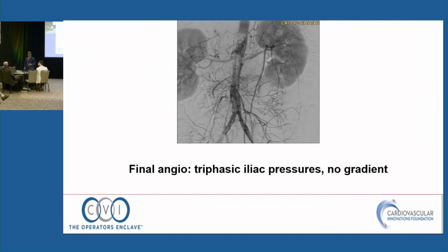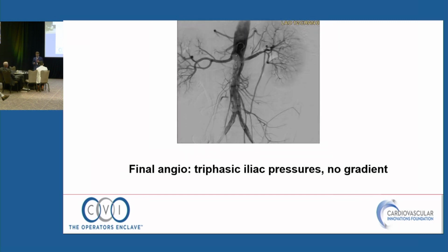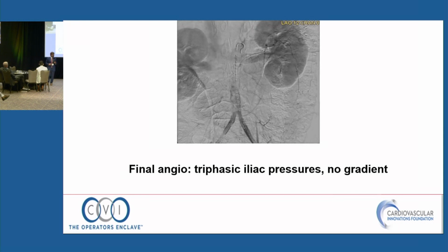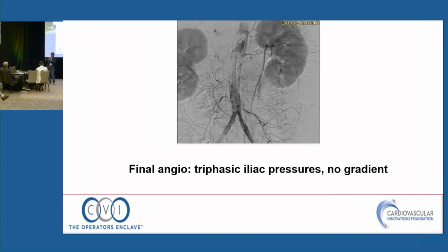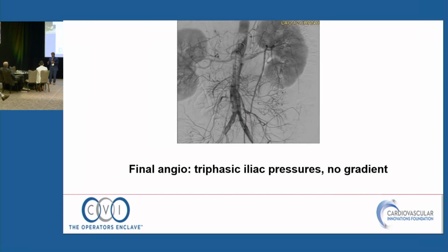What did this look like on IVUS now? So the IVUS, this is a good question because it looks pretty good here. I did IVUS it again. I'm going to lie through my... oh, it looked beautiful. There was no residual stenosis. I'm lying. There was still residual stenosis. There was microcavitation, there was no dissection, and there was still every bit of a 30 or 40% narrowing. But there was no pressure gradient.